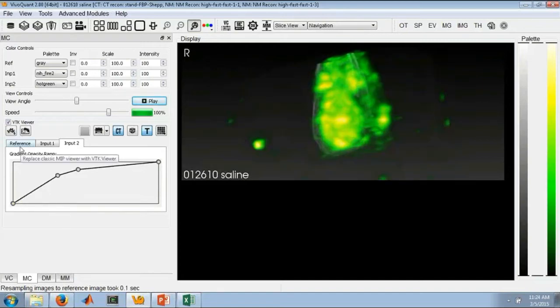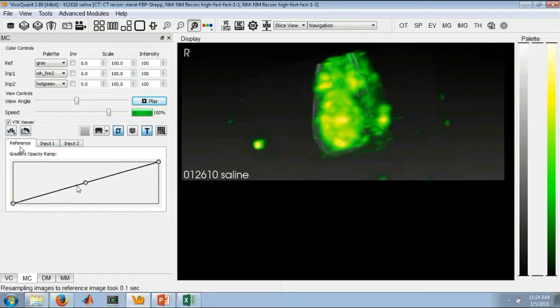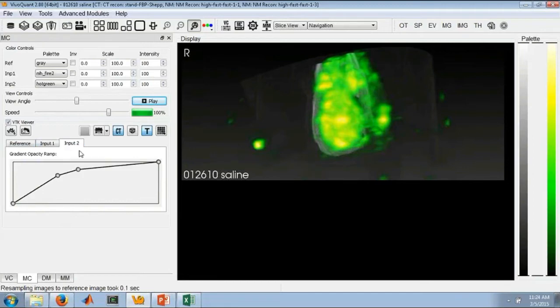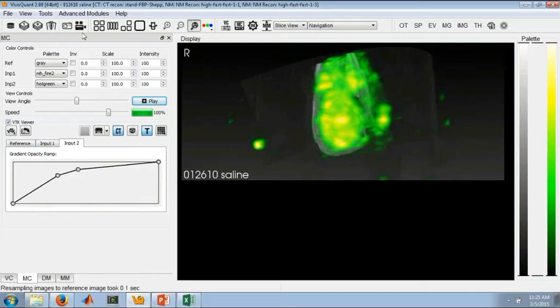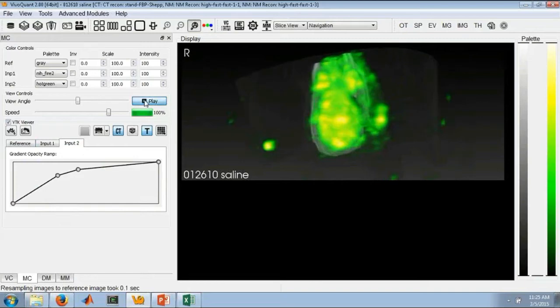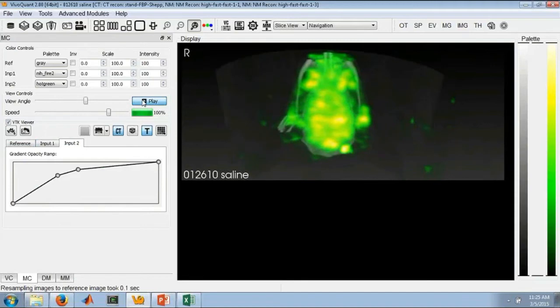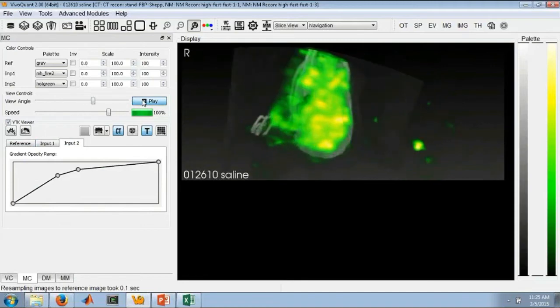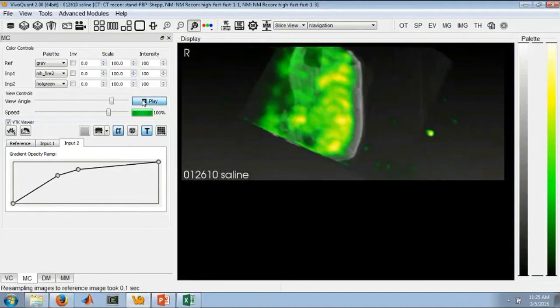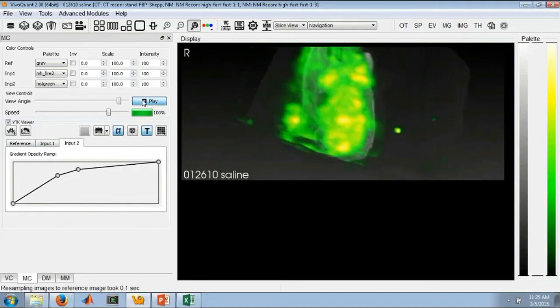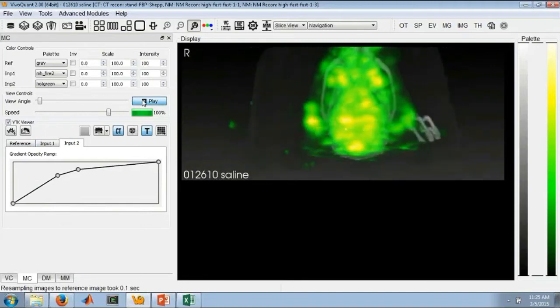I can do that for any of the inputs, whether that's the reference, so if I brighten the reference up, input one or input two. And we still have the ability to make a movie of this data just by clicking the same save movie button that you've always been clicking. And you can also still play your rotating MIP movie, which everyone has come to know and love.